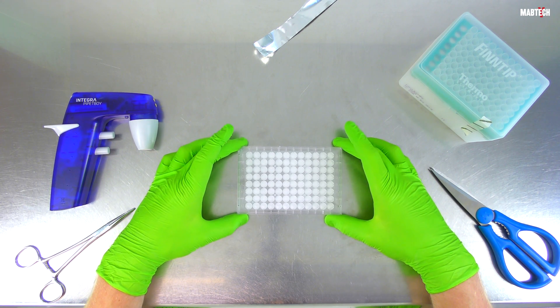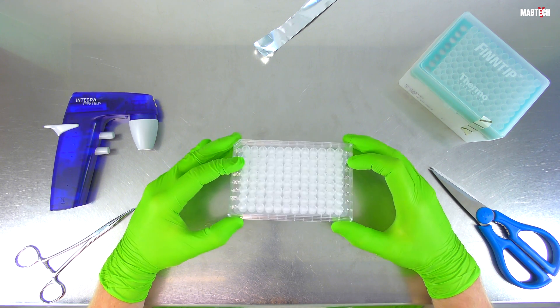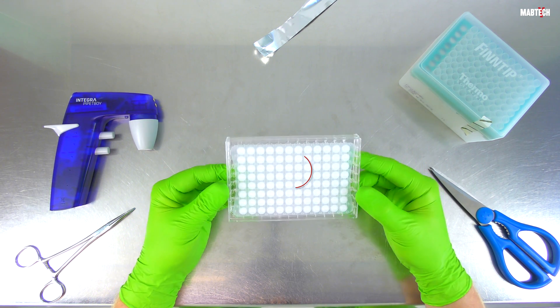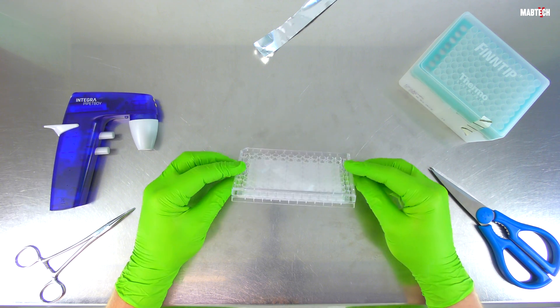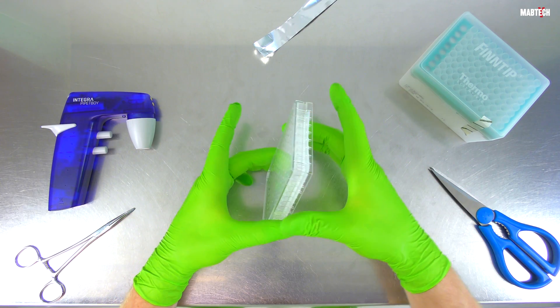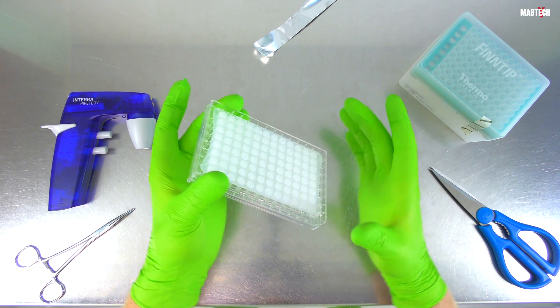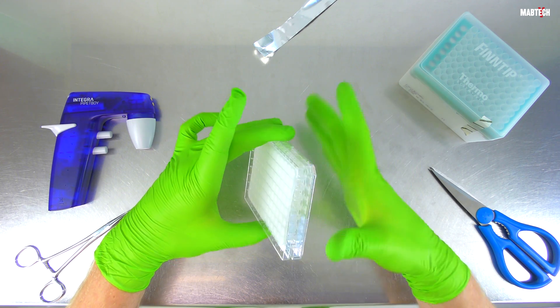ELIspot plates of the MSIP model, whether fresh-coated or pre-coated, come with an underdrain attached to the bottom of the plate. This is a piece of soft plastic put there by Millipore and relates to their use as filtration plates in other types of applications.